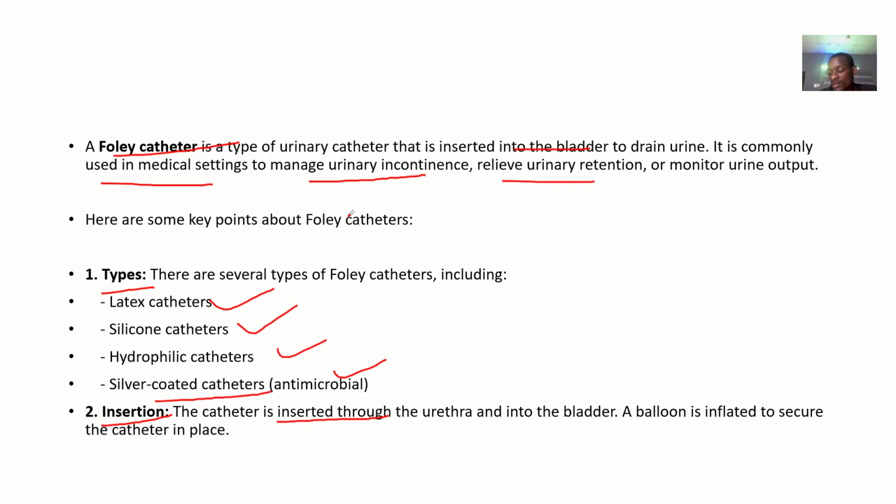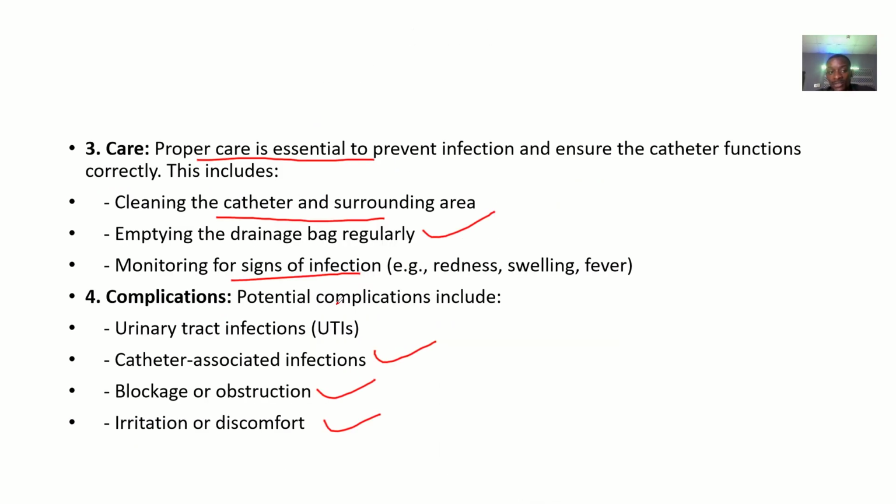Basically talking about types, insertion methods, removal methods, care, and complications.